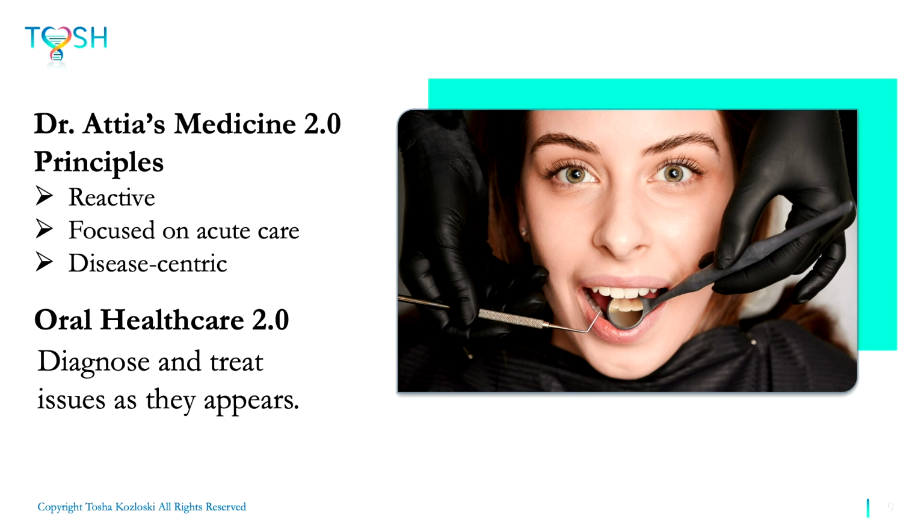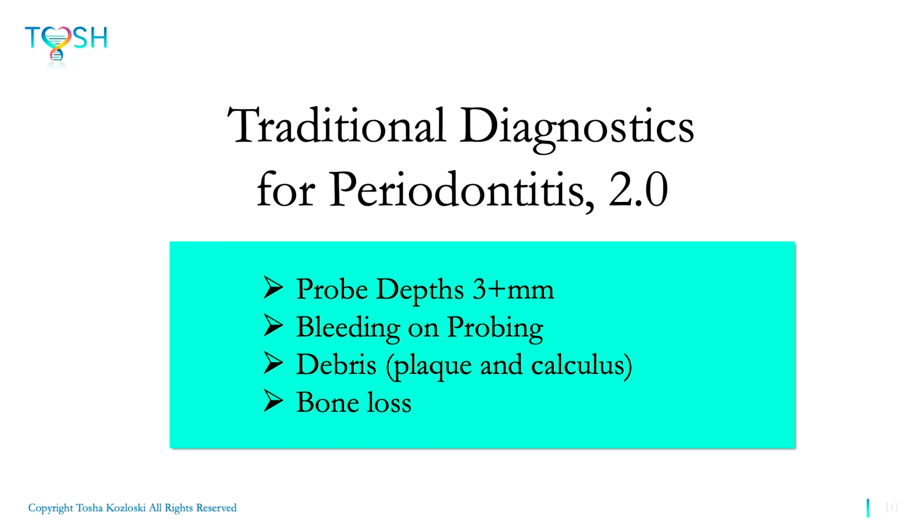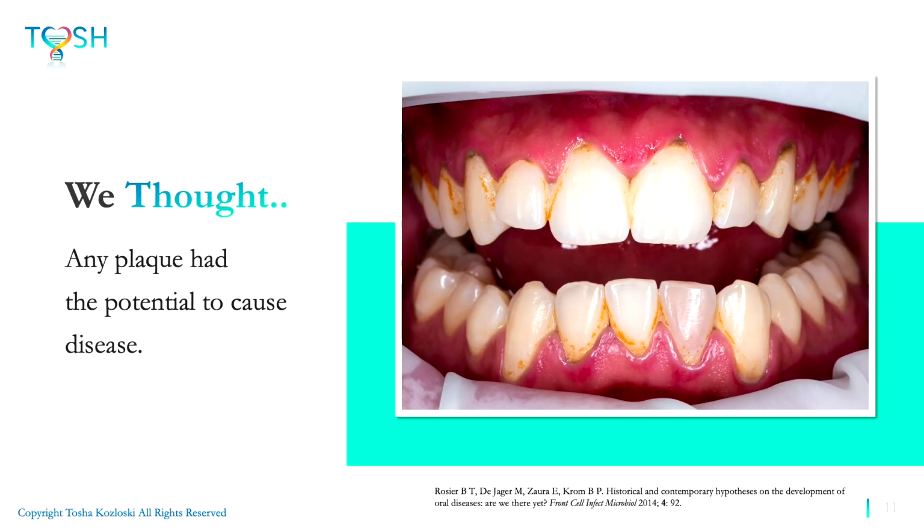Looking at Dr. Attia's 2.0 principles, being reactive, focused on acute care and disease-centric, really we diagnose and treat infections as they appear, generally in our hygiene operatories. And our traditional diagnostic parameters following this 2.0 method are looking at probing depths. Are there bleeding points? Is there any debris? Is there any bone loss? But unfortunately, these are reactive.